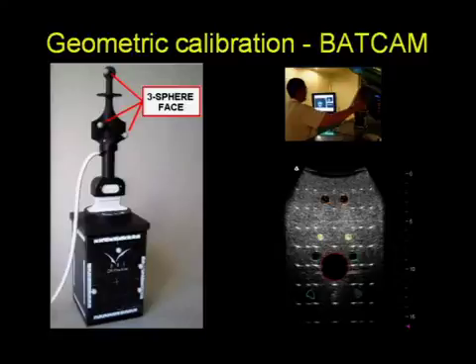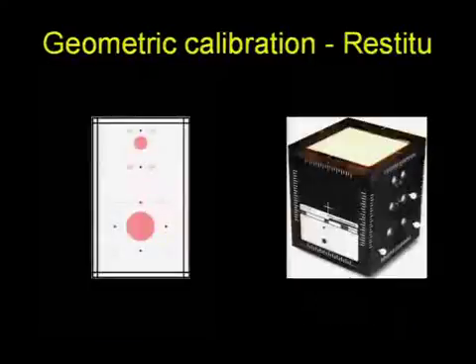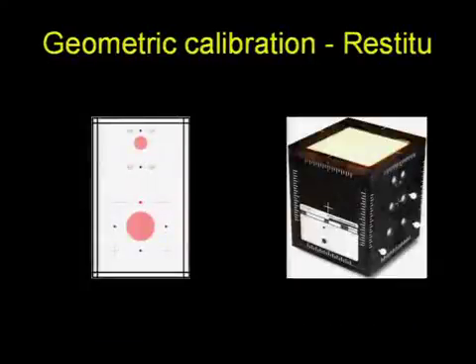So this can be performed on a daily basis. This is fast. It takes about a couple of minutes to do. And again, the Restitu has come up with their own solution using their own configuration of objects within their own phantom.